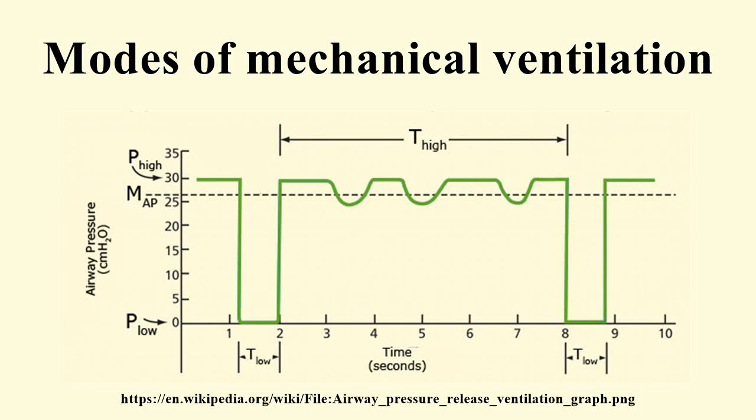Modes of mechanical ventilation are one of the most important aspects of the usage of mechanical ventilation. The mode refers to the method of inspiratory support. In general, mode selection is based on clinician familiarity and institutional preferences. Since there is a paucity of evidence indicating that the mode affects clinical outcome, the most frequently used forms of volume-limited mechanical ventilation are intermittent mandatory ventilation and continuous mandatory ventilation.